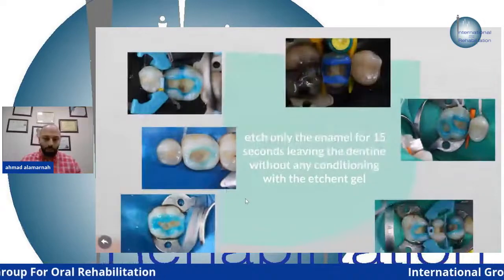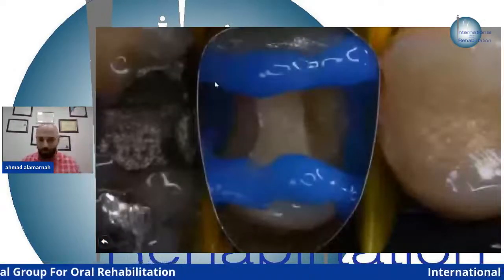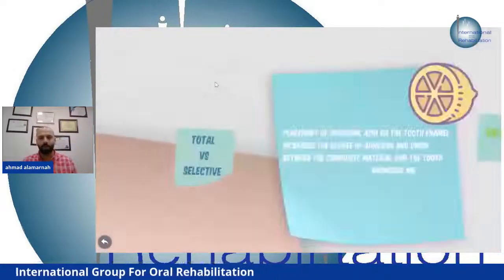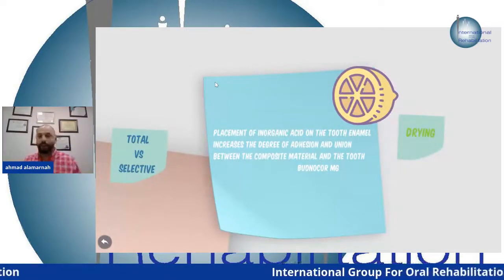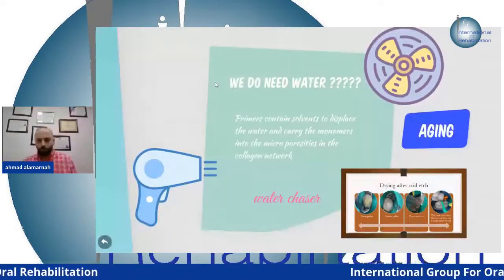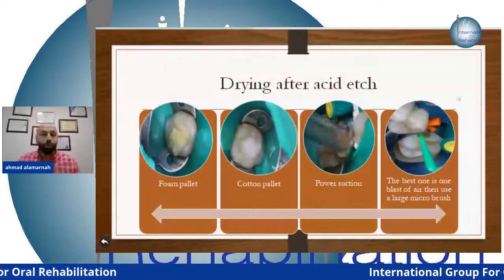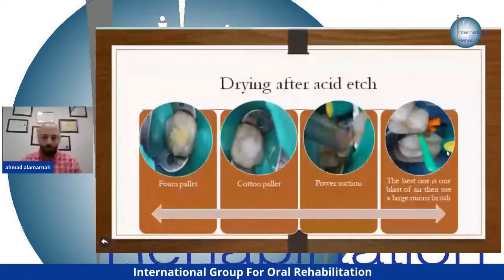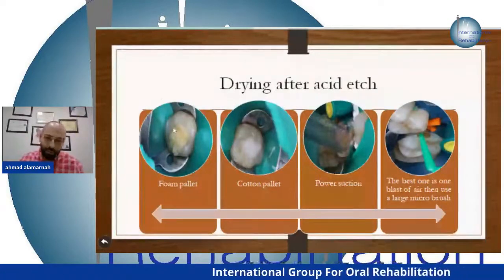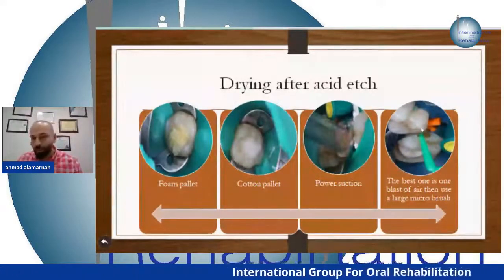This is selective itching — I only etch the enamel. Different brands of acid etching with different consistency and colors. After acid etching, you must remove and dry it — using power suction, a clean bond brush without any liquids, a cotton pellet, or foam pellet. I prefer cotton pellet, foam pellet, and micro brush.